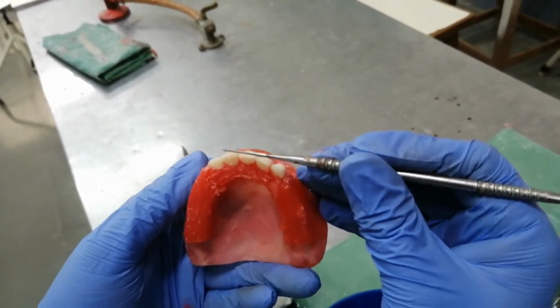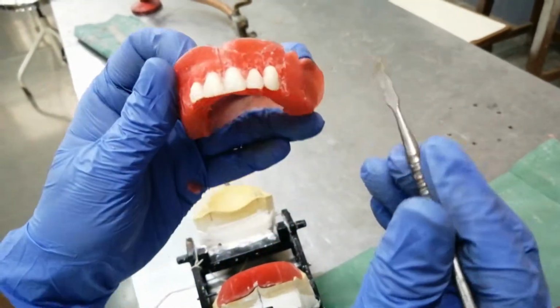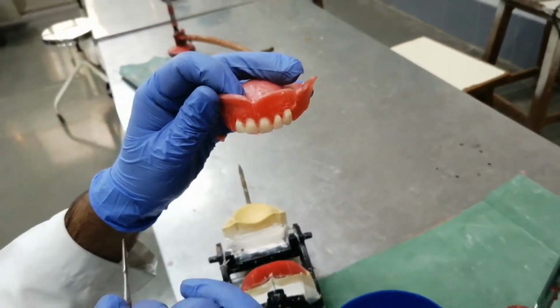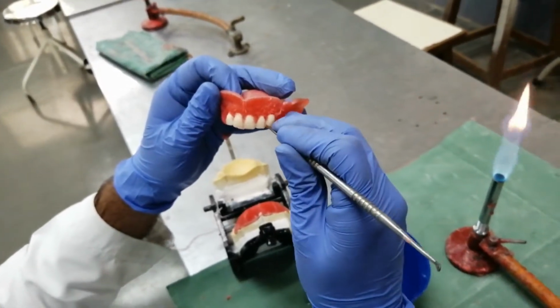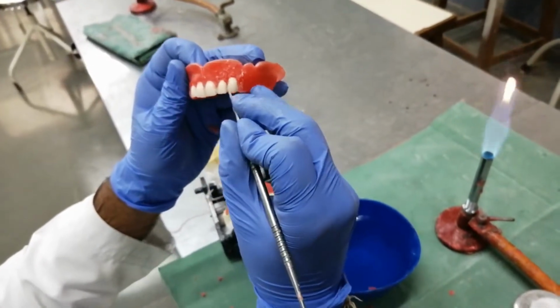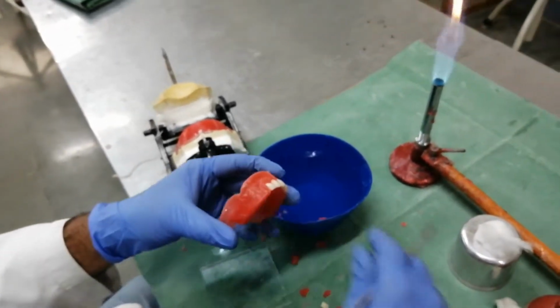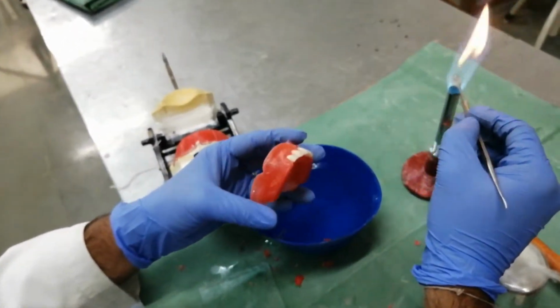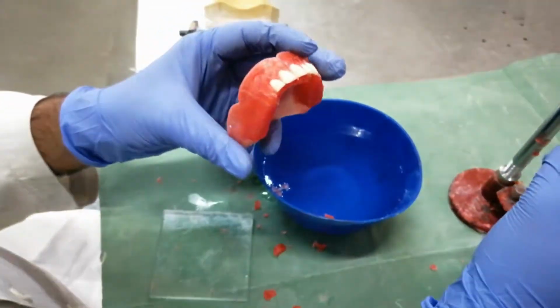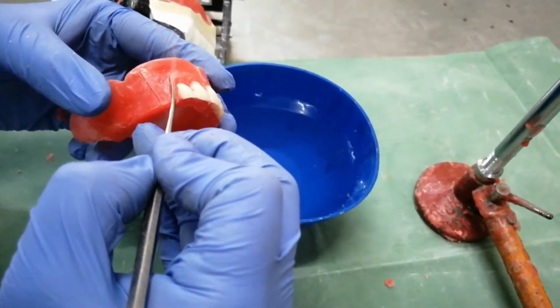Central incisors, lateral incisors, and canine. From the front aspect, you will be able to see only mesial slope of the canine. Distal slope of the canine is not visible from the facial aspect. Similarly, we will arrange another canine.